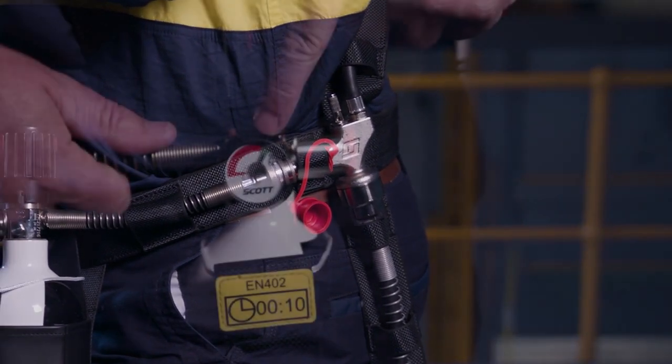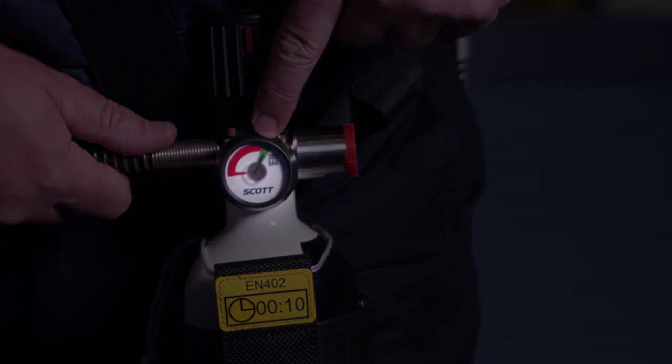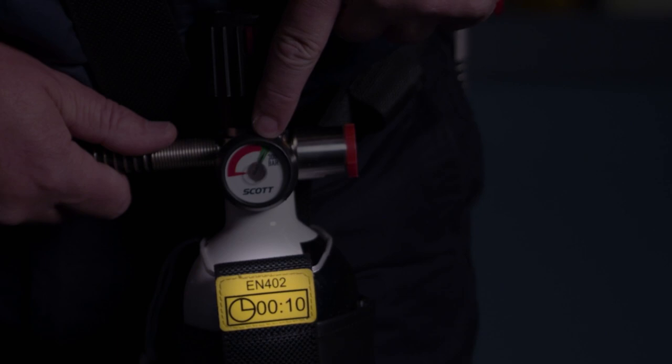Before donning the Flight CoV respirator, check the escape cylinder gauge to ensure it is full, and check the yellow tag to confirm the escape breathing air rating as either 10 or 15 minutes.